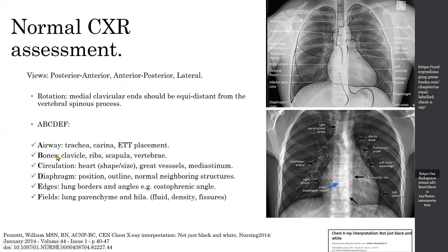B stands for bones, where you assess fractures and pathologies in the clavicle, ribs, scapula, or vertebrae. C stands for circulation, where you assess the shape and size of the heart and any lesions of the great vessels or mediastinum.